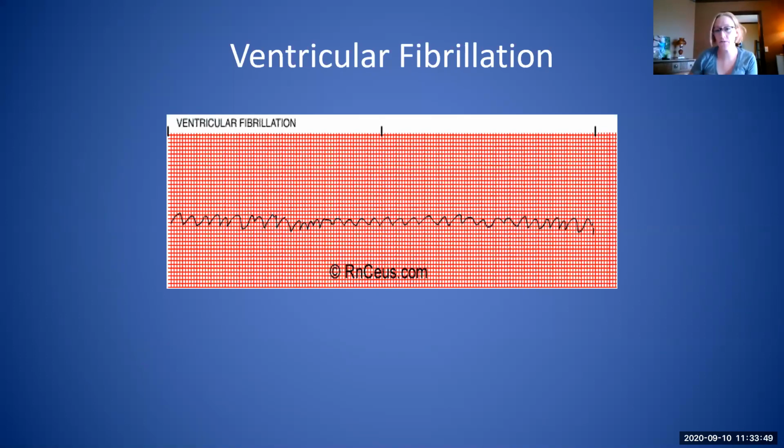Anytime a patient doesn't have a pulse, you're going to start with CPR. We know that. But defib is always like the very, very close second. Like you want to defibrillate a patient as soon as possible, just like starting CPR as soon as possible. And then epinephrine is going to be our first drug of choice for any pulseless rhythm. Anytime a patient no longer has a pulse, epi is going to be the first drug of choice. But again, our anti-dysrhythmics are a potential option as well with our amiodarone and lidocaine after that, but epi is always going to be our first choice for pulseless.